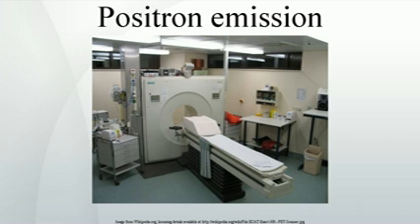As the radioisotope undergoes positron emission decay, also known as positive beta decay, it emits a positron, an antiparticle of the electron with opposite charge. The emitted positron travels in tissue for a short distance, typically less than 1 mm, but dependent on the isotope, during which time it loses kinetic energy, until it decelerates to a point where it can interact with an electron. The encounter annihilates both electron and positron, producing a pair of annihilation gamma photons moving in approximately opposite directions.